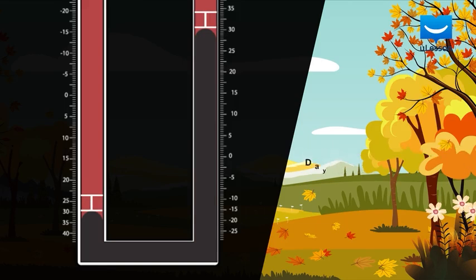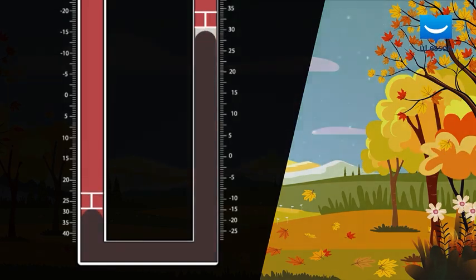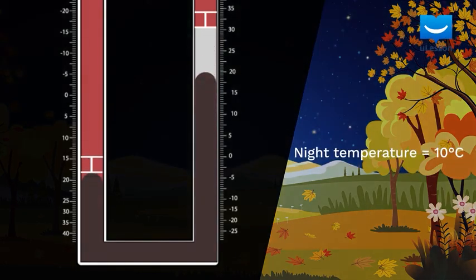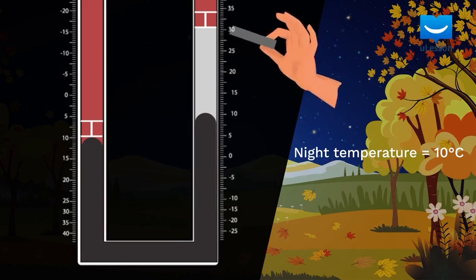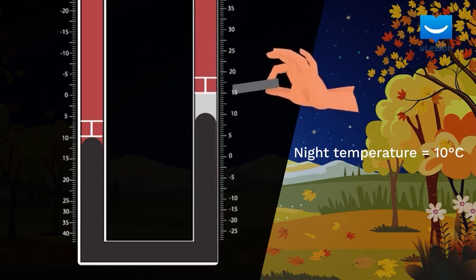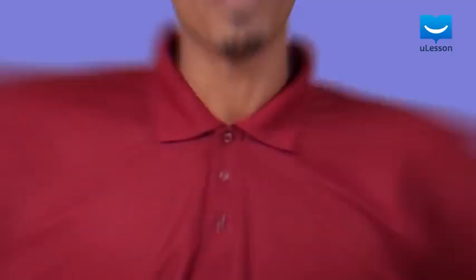As the temperature begins to drop, it causes the alcohol to contract. Mercury moves up the minimum arm, pushing the minimum index upwards until it reads 10 degrees Celsius. Note here that it is the expansion or contraction of the alcohol which measures the temperature. The mercury indicates the temperature reading on both scales. A magnet is used to reset the indices by bringing them back in contact with the mercury.